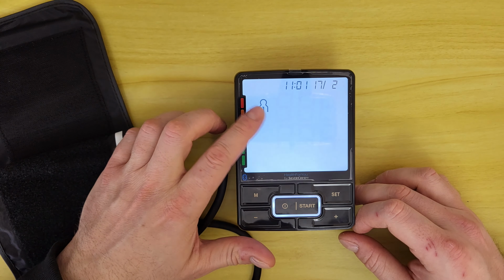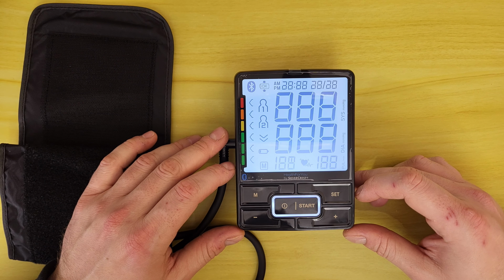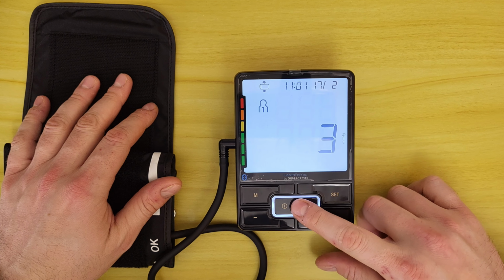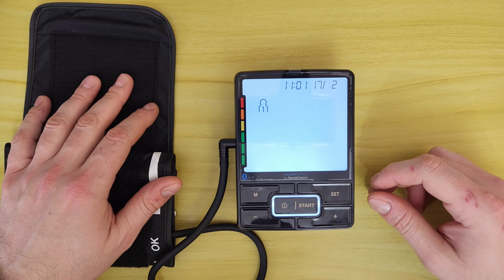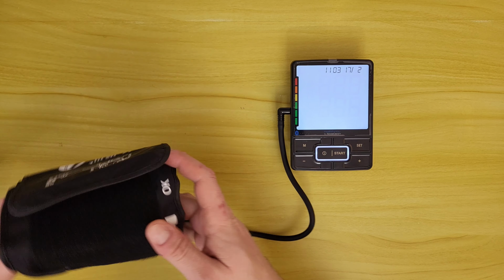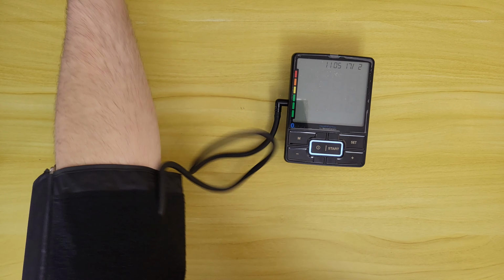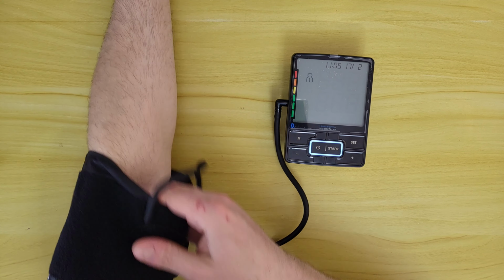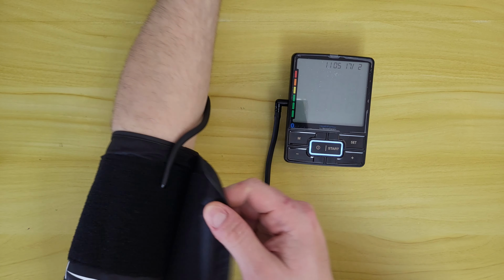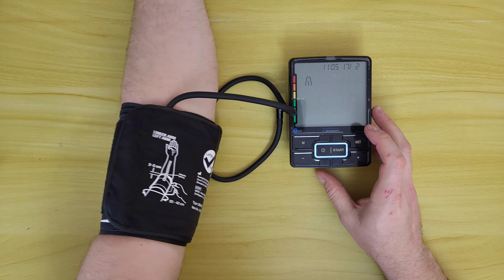turn on again, and we can see we've got one person. I'm the first person, and by just pressing, we can see all the values. And it starts inflating, and stop. Turn on again. Well, let's wear it to see how it fits me. This needs to be at this position here, at the joint, and then tighten it, not too much, and I think it will be okay. And start.